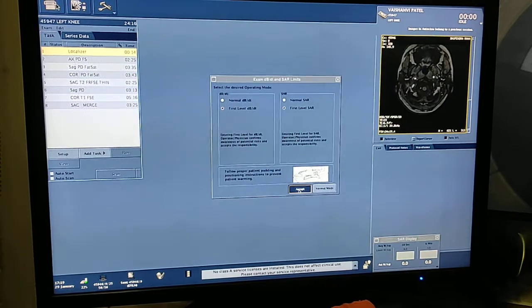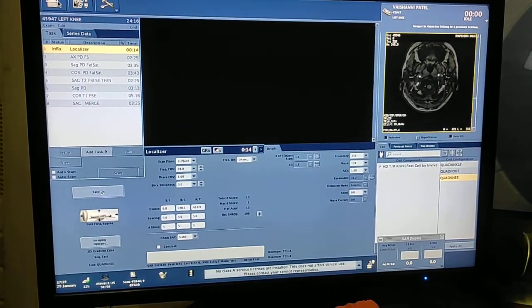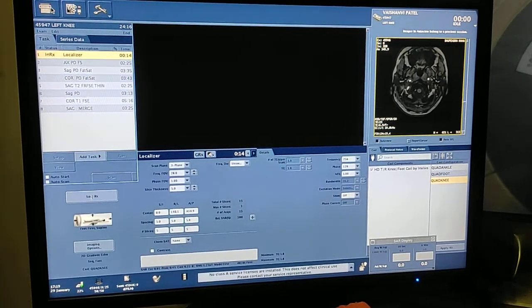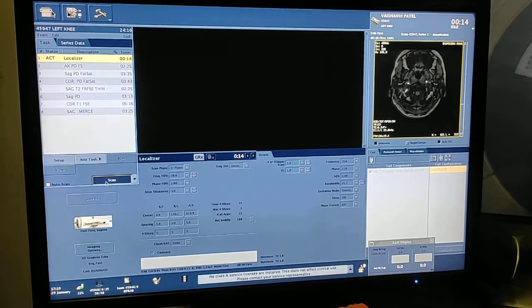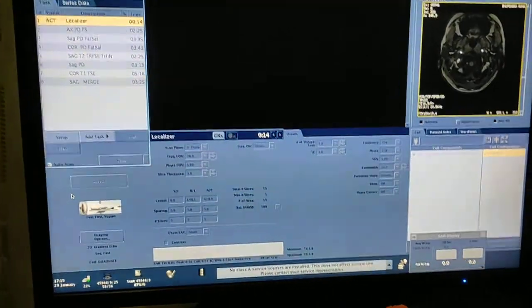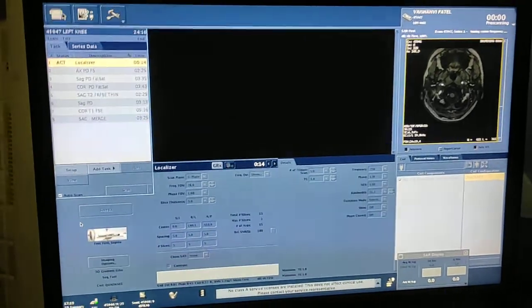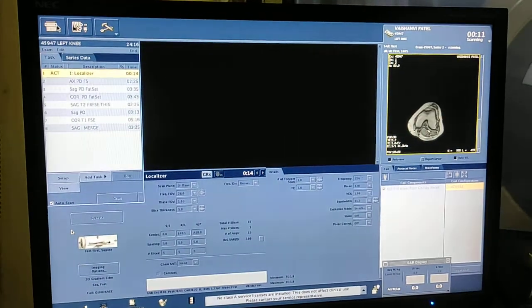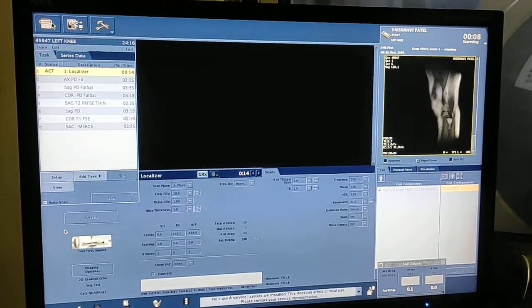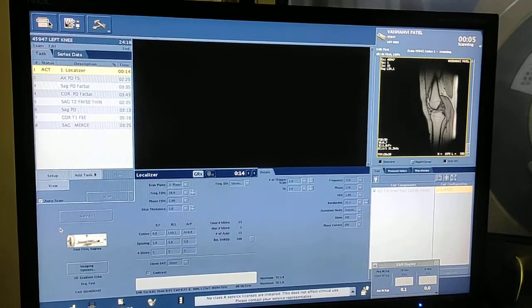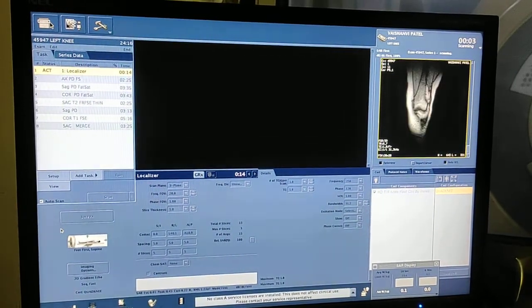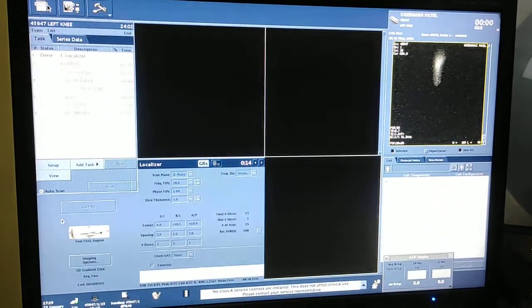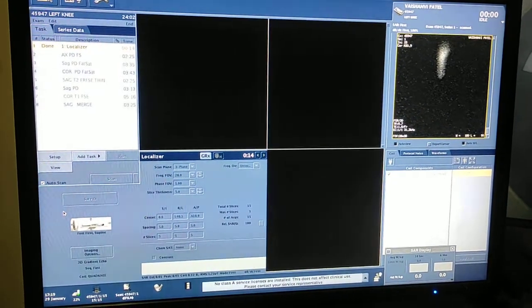Now start the scan. First of all, you have to take the pre-plan localizer — accept, save RX. I am going to take the three-plane localizer. Before scanning, you should always take patient history: what complaints they are having. Some might have only pain, some might have trauma, so according to that you have to plan the images. Always ask patient history before scanning.